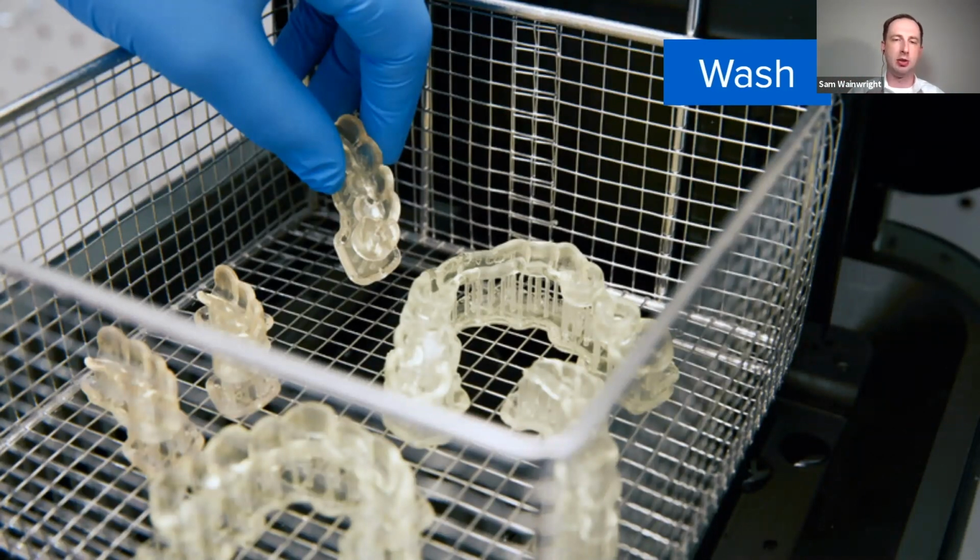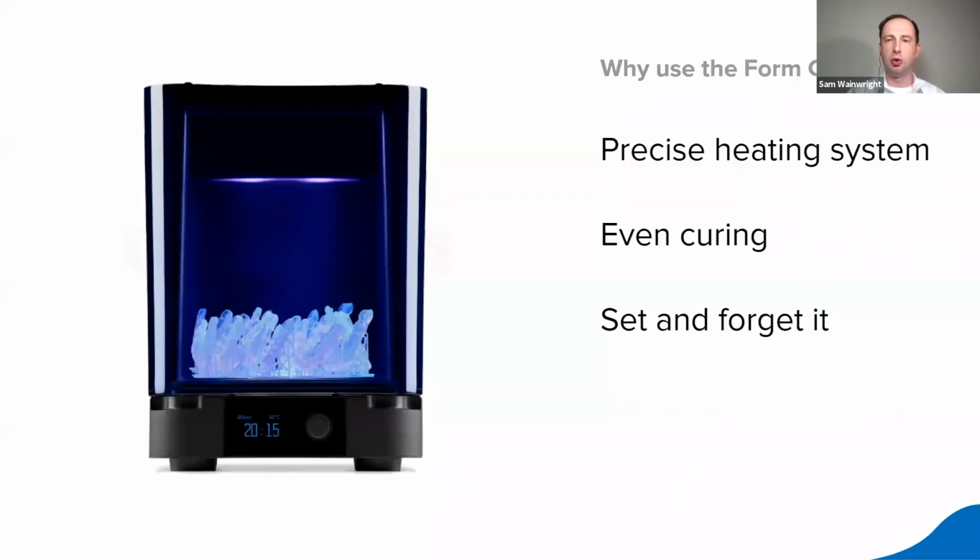So the really nice thing about this is you can set it to go on lunch. It's not sitting in there degrading the part or anything like that. It's completely self-reliant. Next, once the parts are dried, they need to be UV cured.